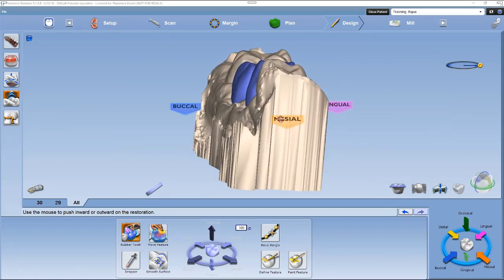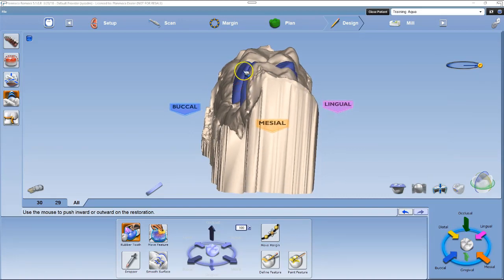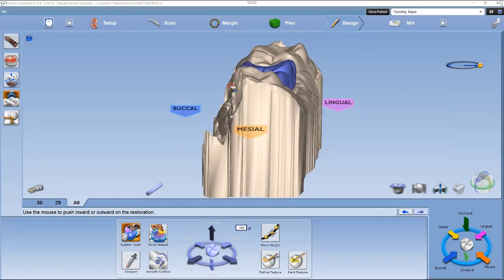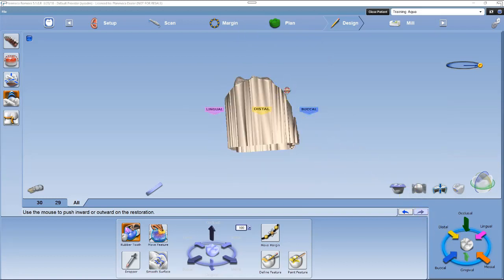The second step: left-click the mesial arrow in the quick view circle. Do three slight rotations staying on the mesial view. The first rotation is to evaluate the buccal contours — the restoration should follow the neighboring teeth contours. Next, a slight rotation to evaluate the lingual contours to follow the neighboring teeth. The third rotation in the mesial view is to evaluate the mesial marginal ridge, which should be at the same height as the mesial neighbor's marginal ridge.